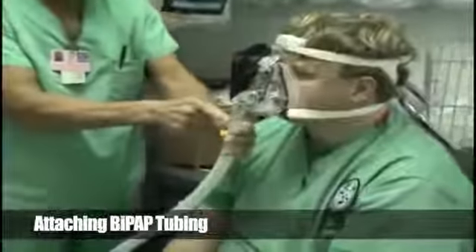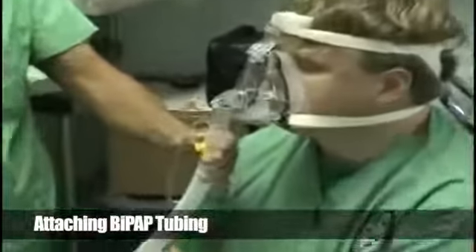Here the head strap is being fastened to the face mask on the right side, as is demonstrated here. Now the top portion of the mask will be attached to the head strap. This top portion can have fine adjustments in or out, up or down to optimize patient comfort. Here the BiPAP tubing is connected to the patient with the carbon dioxide release valve away from the patient.